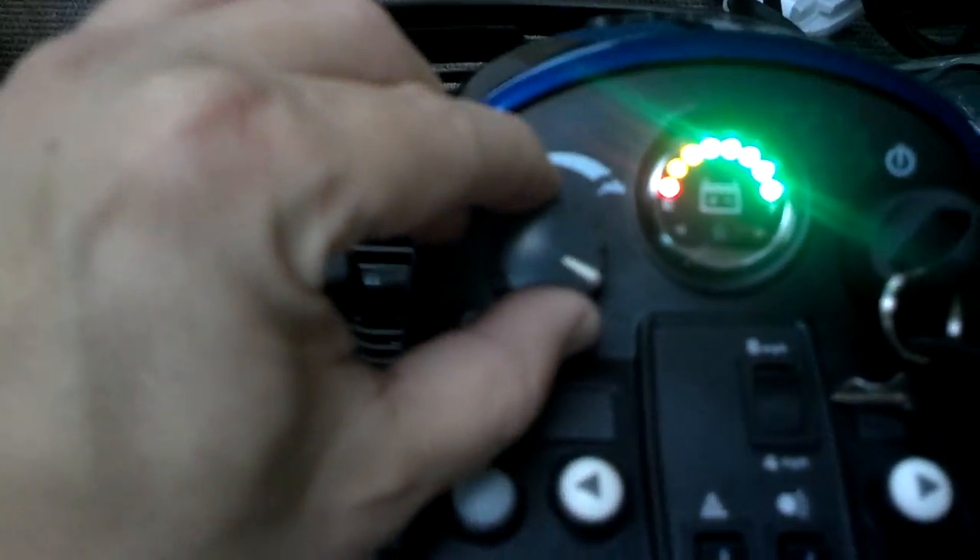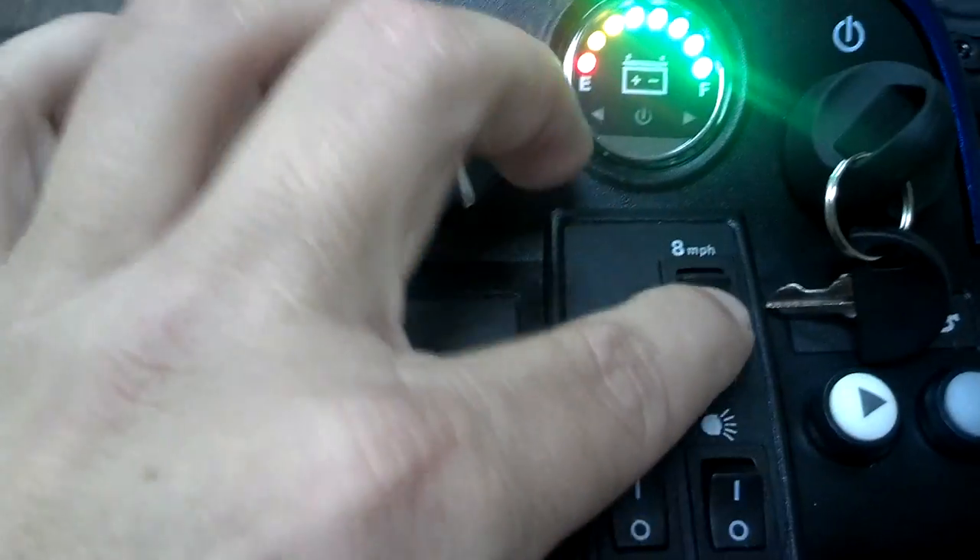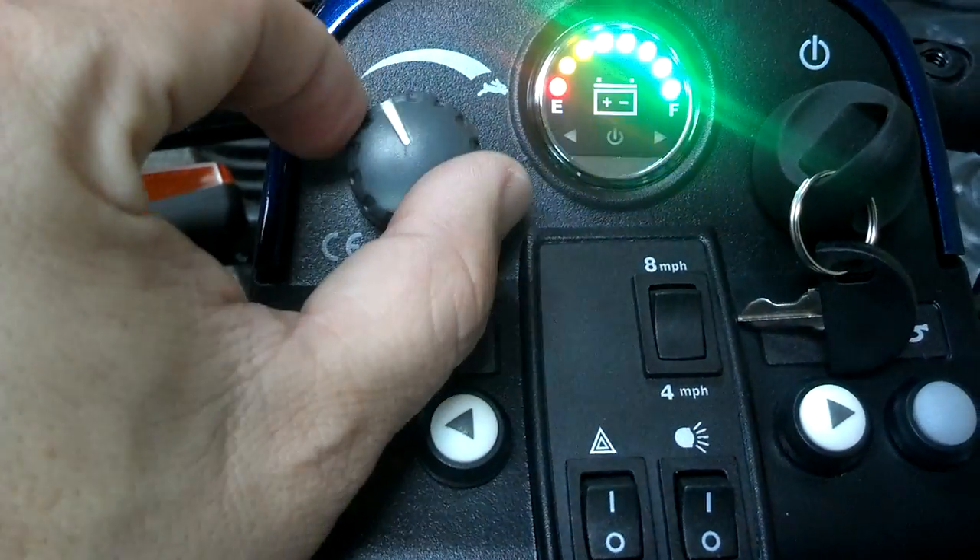A couple other features this thing has: this is the charger right here — it comes with a charger. It does have a couple of switches, which is new. It has an 8-mile-an-hour switch right here, and then it has a 4-mile-an-hour switch. That'll manage how fast it goes. This is so you could turn it down from 8 to 4, and then if you have it switched to 4, it'll turn down to 1 or 2 miles an hour.